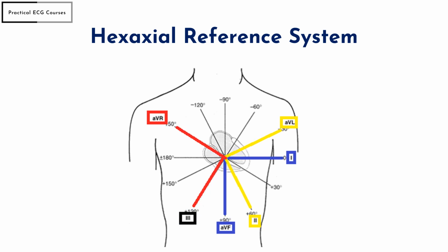So the only new thing here is the degrees, and the degrees are simple. Let me show you how. So the first axis, this one is 0. If this is 0 degrees, then this is 180 degrees. So you have 6 axes, then each axis must be separated by 30 degrees.